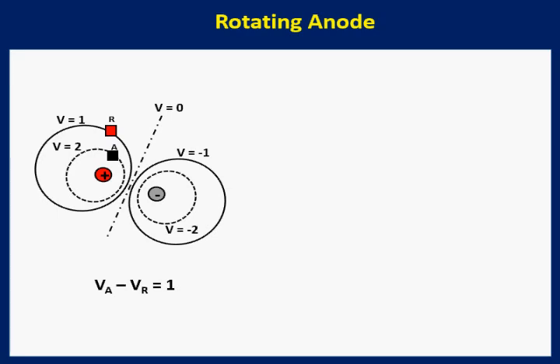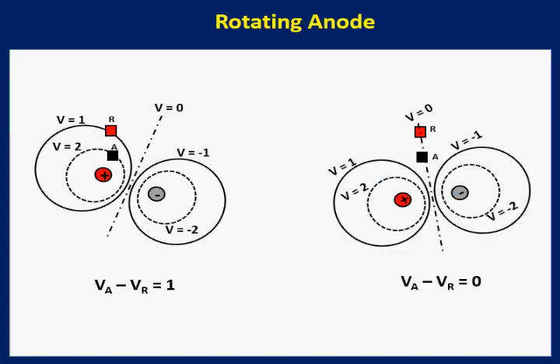To reduce the artifact, one maintains the position of cathode over the nerve. The position of anode is changed to get the E1 and E2 to lie on isopotential lines with similar voltage. Now the active and reference electrodes are recording the same potential, and it will be cancelled by the differential amplifier.